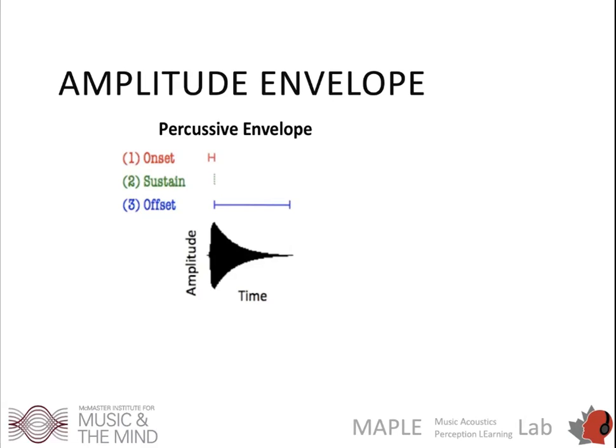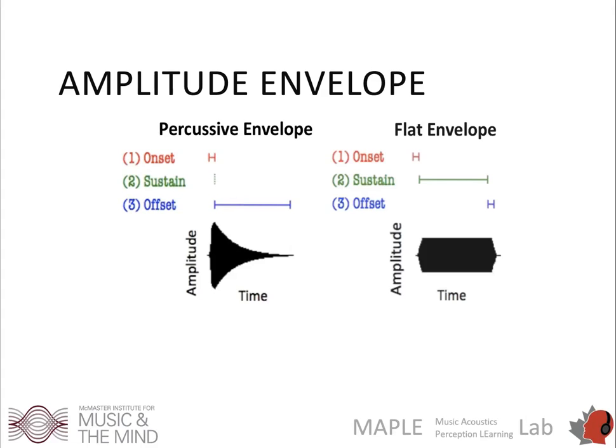Now, although these sounds are fairly common in nature and in many ways very pleasing to listen to, they're not often the kinds of sounds that are used in medical devices. These sounds are more what I call flat sounds, which have a sharp onset and a long sustained period, followed by a rapid offset period. Here are some examples of some flat tones you might have heard.